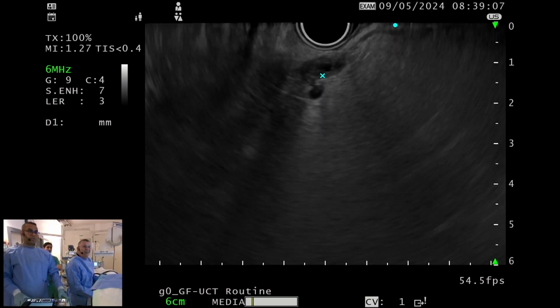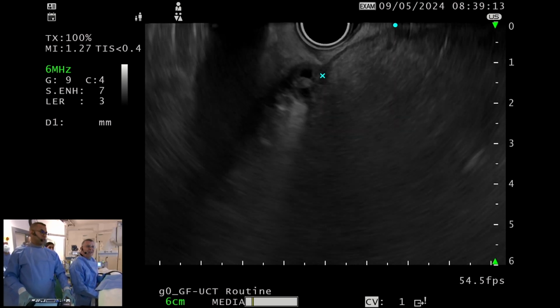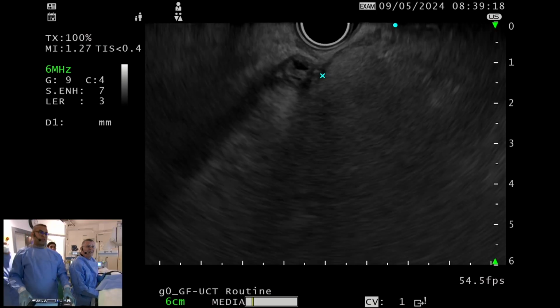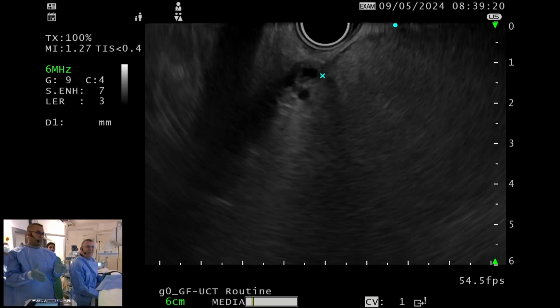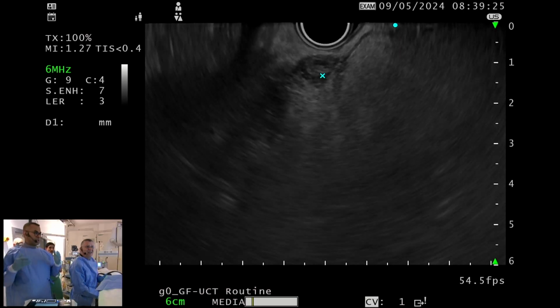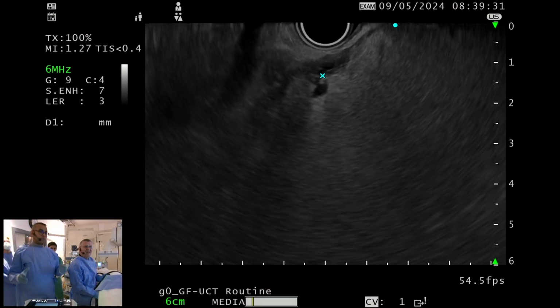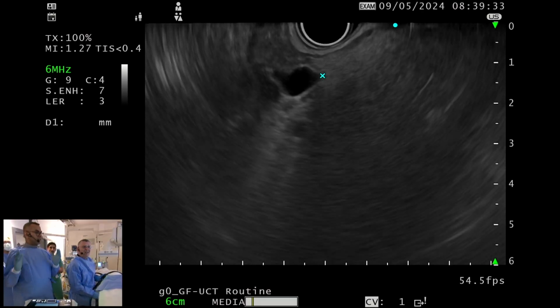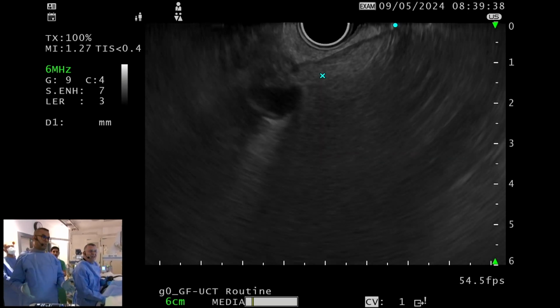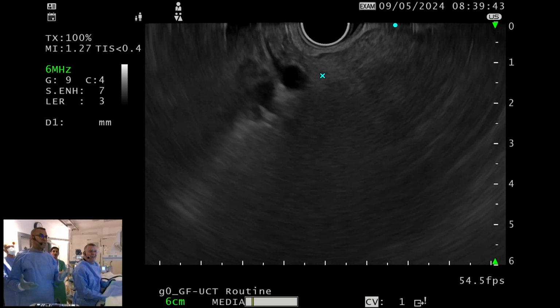Dr. Palazzo, I just want to make a few comments here on this case. This is not uncommonly seen in our referrals in the clinic where we have a dilated duct that is disproportionate for the age, because we have to understand that after the age of 50, you can add for each 10 years 1 millimeter dilation. The normal duct is 6 millimeter or less. That's the normal physiological dilation. However, there are certain conditions that are not related to any underlying pathology, including, as Dr. Palazzo mentioned, if you have a cholecystectomy performed, it is expected that the duct will act like a reservoir and they will start to dilate.